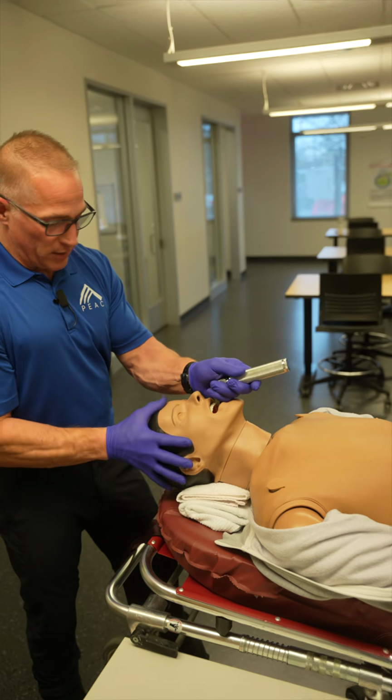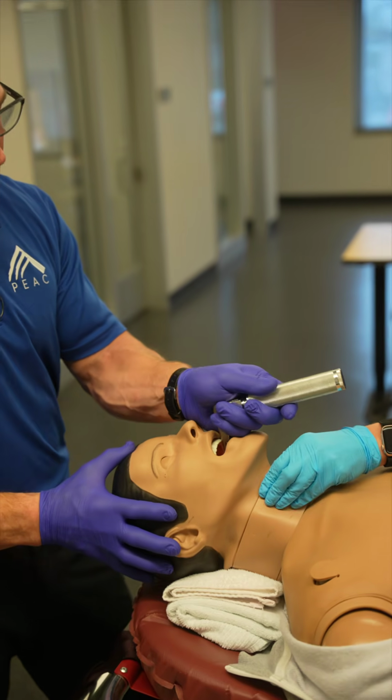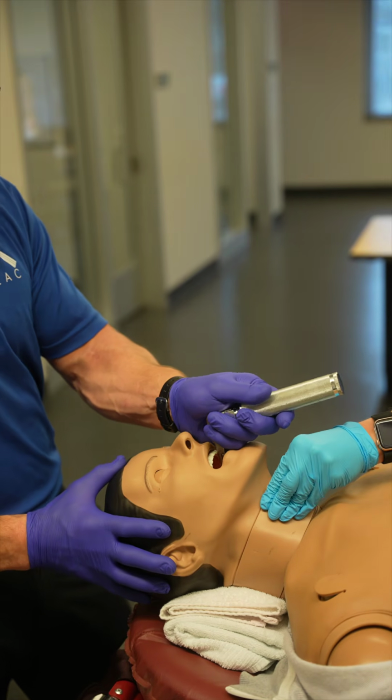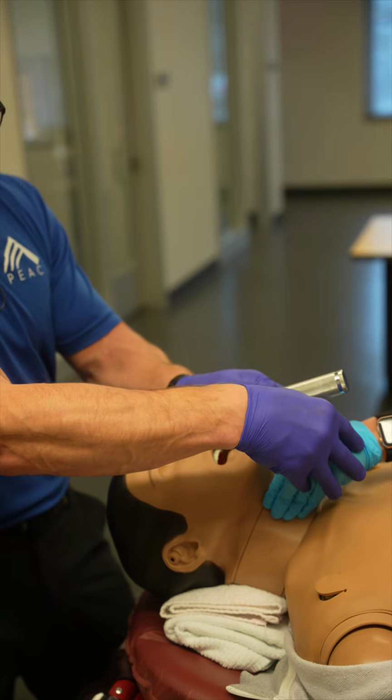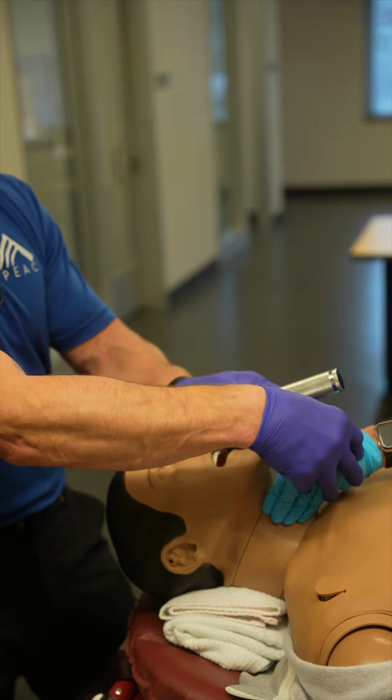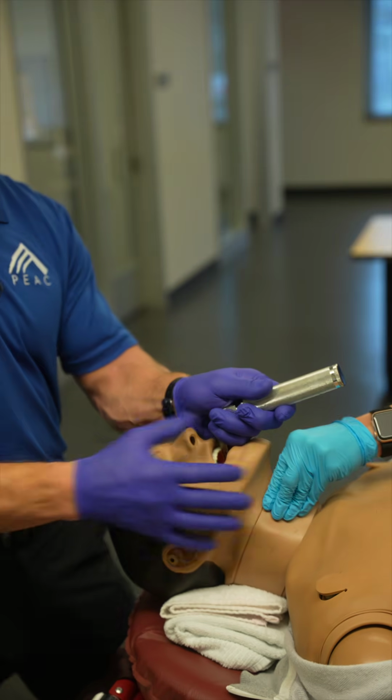With the difficulty in seeing cord presentation, I can then have my partner come in from the front and provide some ELM, external laryngeal manipulation pressure, and then I can dictate that partner's pressure, helping align the oral, pharyngeal, and laryngeal axes to help intubate the patient.